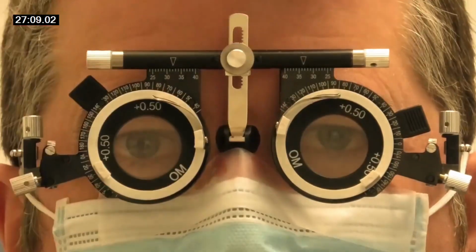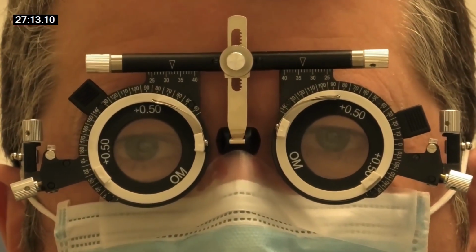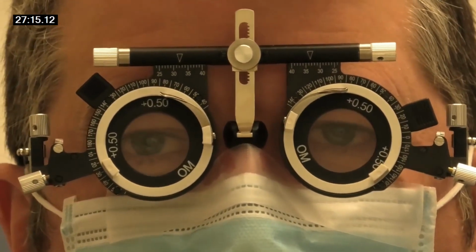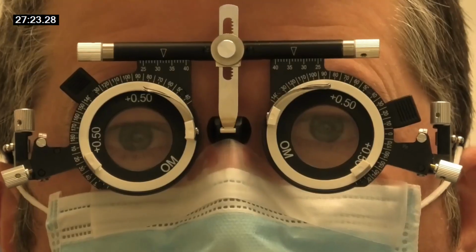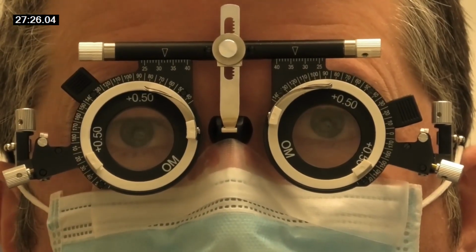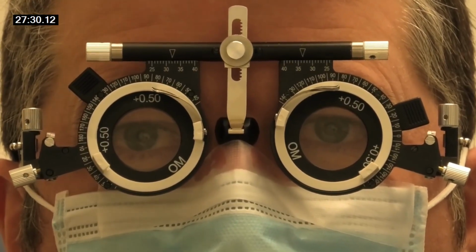That's good. So now I suppose we could do your +0.25. Yeah, that's right. So do that on the letters. And in this phase, we're not going to get any better, are we? No. Because we've got really good vision. So it's either going to be the same or worse. Okay. So if it's worse, then we don't do it. If it's the same, then we do give it.